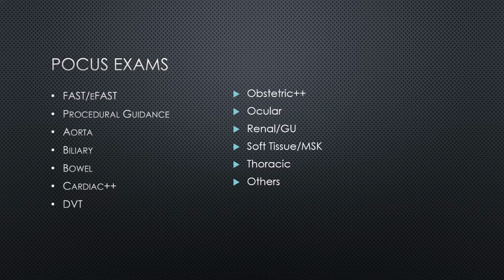And there's a couple of particular ones I want to highlight here, both the cardiac and the OB. There are invasive and non-invasive versions of those exams, right? So for cardiac, you have transthoracic echo, and you also have transesophageal echo. And for OB, you have transabdominal OB exams and you have transvaginal OB exams, and ACEP differentiates those out as well. So in addition to the 25 cardiac studies, this would be like TTE, that you would need to be credentialed as an attending, you would need 10 TEEs to be credentialed in TEE as an attending, per ACEP's guidelines.